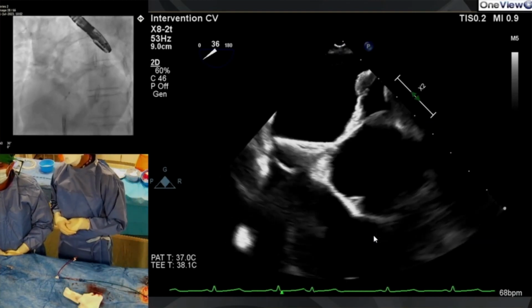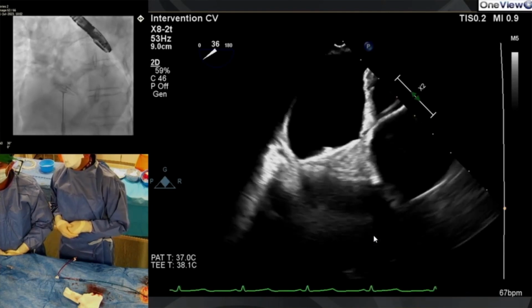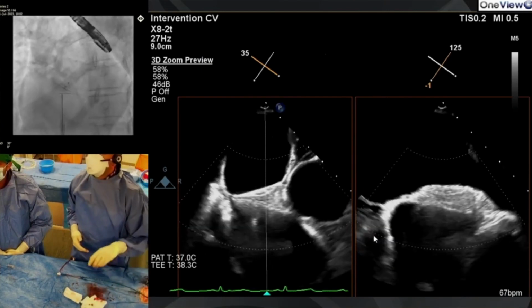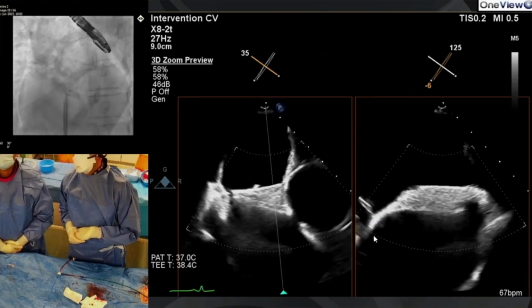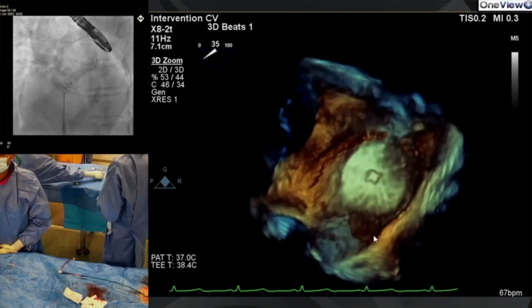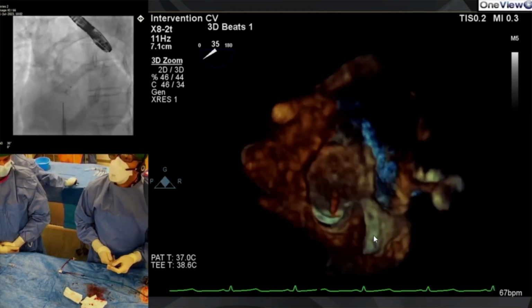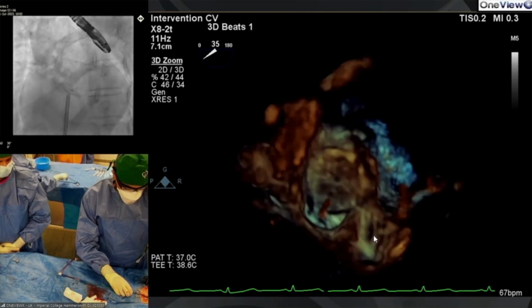The reason I prefer small discs on the left side, and I don't think it's really an issue here, is the touching-the-aorta business. It's not really been mentioned, but it's not a huge issue for PFOs. And I think it's probably going to just move off the aorta when you release it anyway. But if you have a big disc, the reason for preferring smaller discs on the left, as well as having less metal on the left, is because sometimes they touch the aorta. It's a good example because it's very close, but I don't think it's an issue here. To my eye, that looks actually very nice.